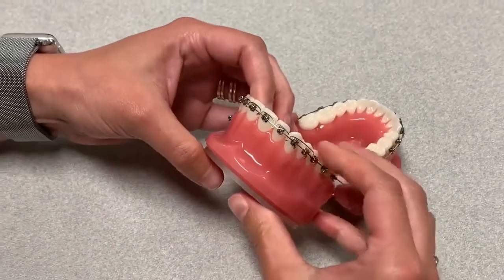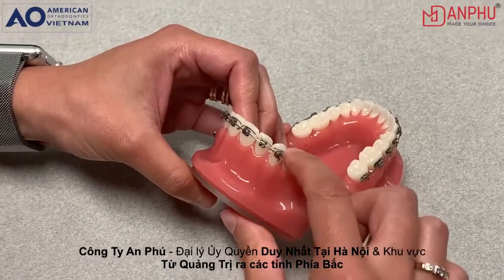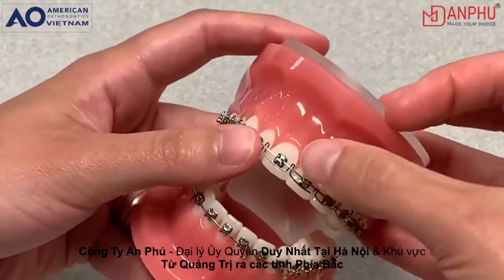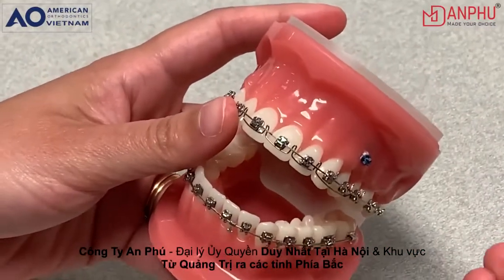The other thing that a lot of users who have used this in the past — they'll also steel ligate this on the cuspid. Because as you can see here, if a patient is chewing something hard and pushes here, this whole thing would unwind. So that just helps to avoid emergency appointments.